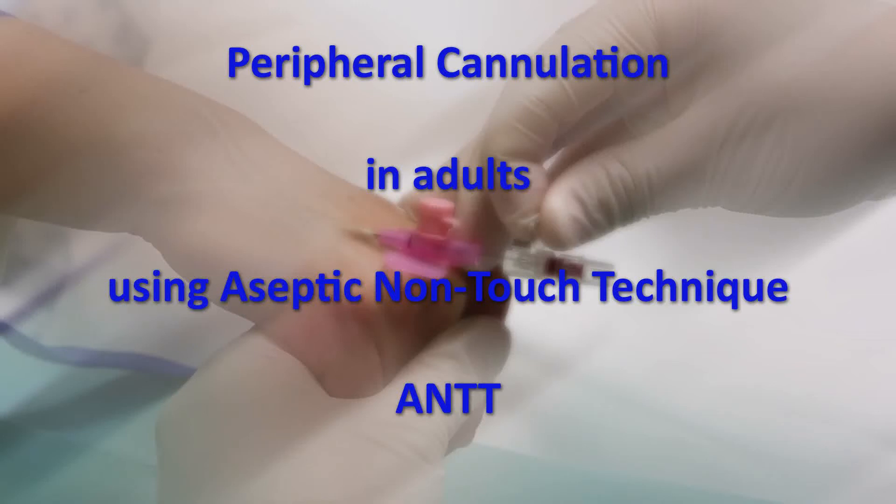This training video demonstrates peripheral cannulation in adults using aseptic non-touch technique. These guidelines focus on the sequence of infection control steps necessary to ensure clinical procedures are performed aseptically.